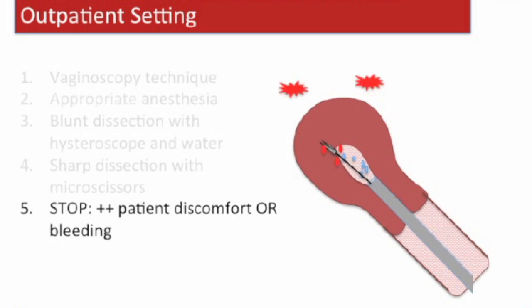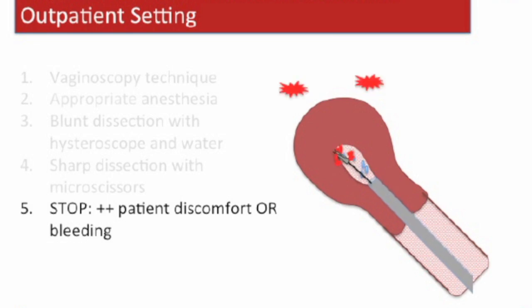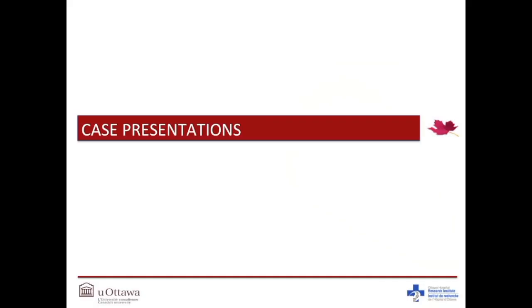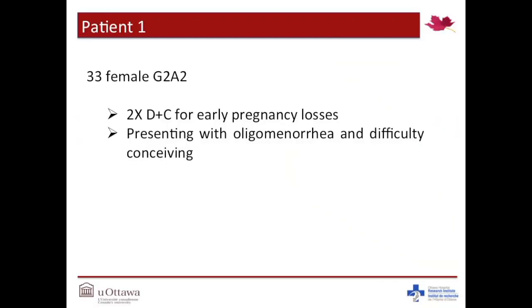You must stop and re-evaluate your location within the uterine cavity when the patient experiences a sudden increase in pain, or if you encounter excess bleeding. We will now present several cases of outpatient hysteroscopic adhesiolysis.